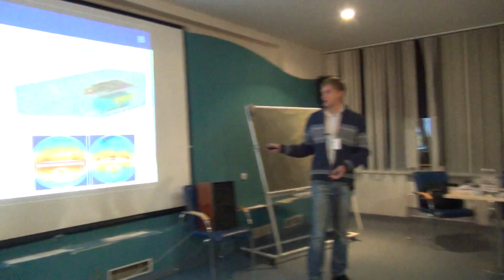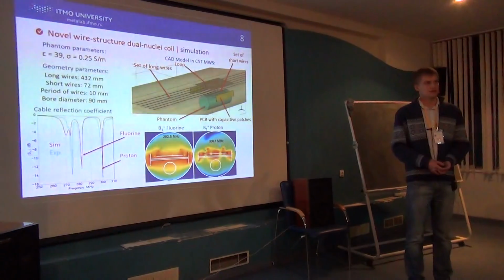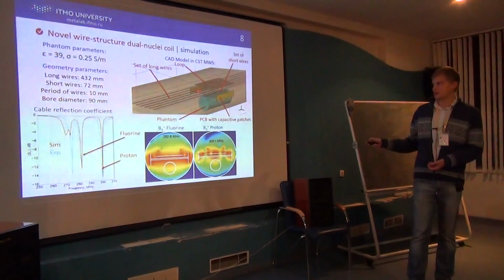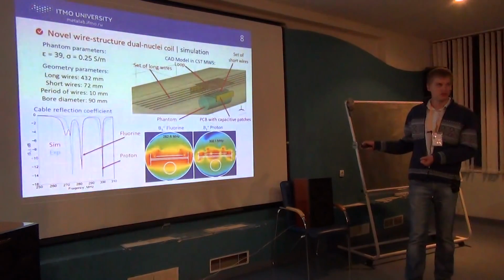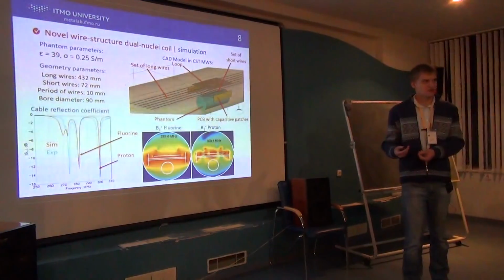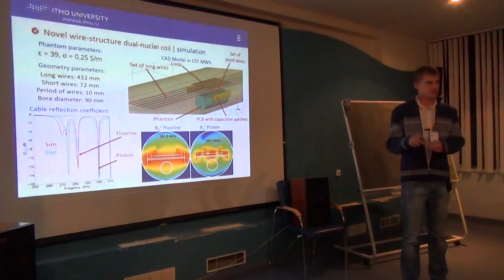The square patches allow us to make the resonant wires shorter. For example, these long wires must be approximately half a wavelength. Okay, how do they allow us to make them shorter? Because you can imagine that this structure is composed of two-wire transmission lines. For example, these two wires can be a transmission line, and the wave can travel along the wires. If you want to make it shorter, then you need to mimic somehow the properties of this termination. So you can load it with the rest of the line, or you can load it at this point with something else, which will have the same properties. And from the theory of transmission lines, it follows that here you need to put a capacitor, and you will not change the field on the internal part, and you can just throw away these ends if you have the capacitor. Okay, I get it.